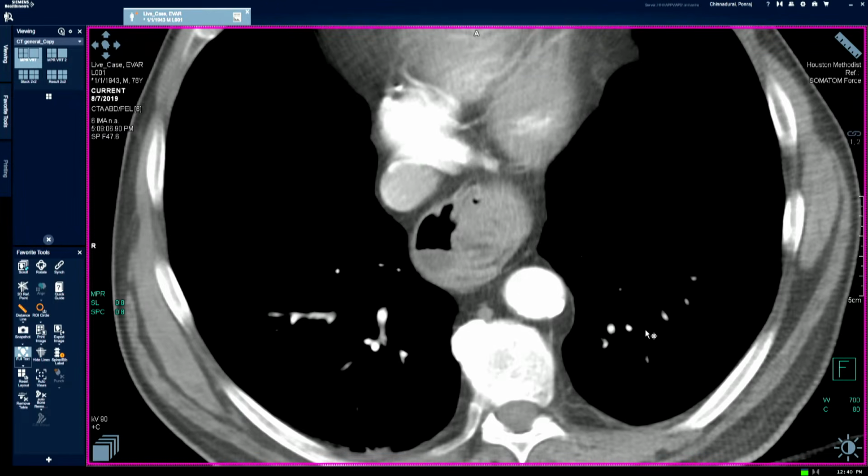The short answer is that these are just random guesstimates based on the histogram. What the algorithm is doing in the background is creating a histogram of all the intensities and giving you a window. This can vary depending on whether it is a 5-month-old baby versus an 80-year-old who might have highly ossified bone.